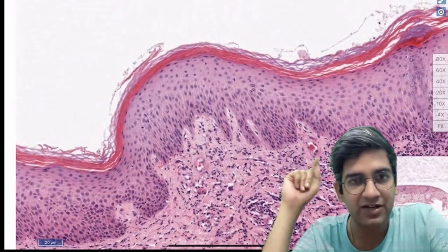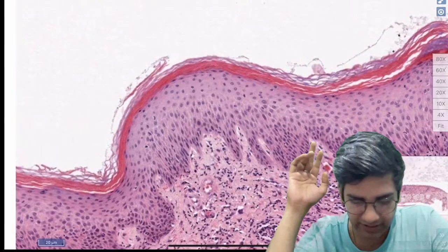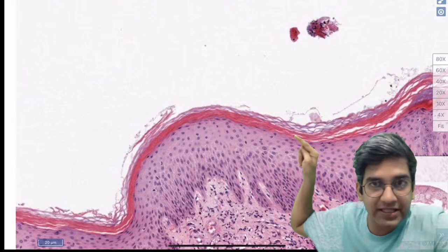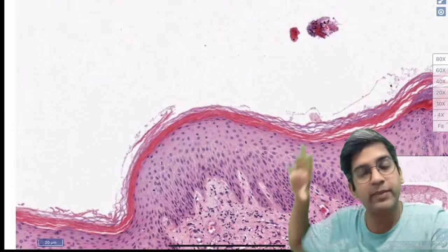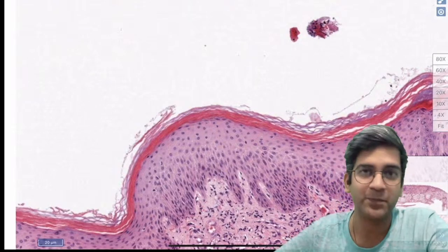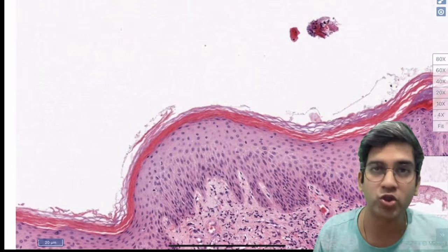Can you see the basal layer of epidermis? Yes, decent. Stratum corneum is there. Yes. In the stratum corneum, do you have anything called parakeratosis? Parakeratosis is when you see nucleus in the stratum corneum. No. Simple, normal. Is the entire length of epidermis bigger or normal? Okay, great Praneet, great Junu. I want others also to comment. Do you feel it's normal? It is normal, right? So epidermis more or less looks normal to me, right?